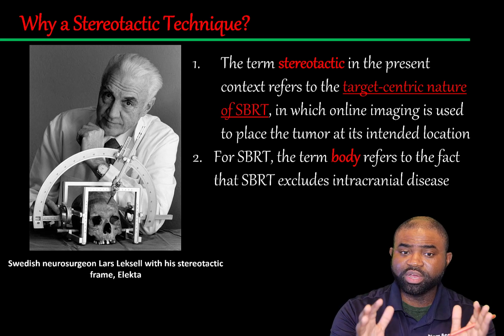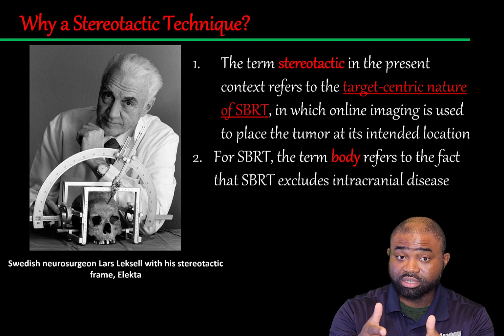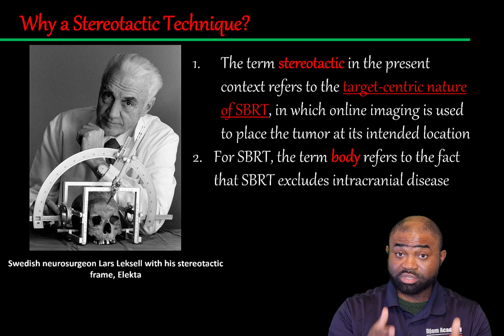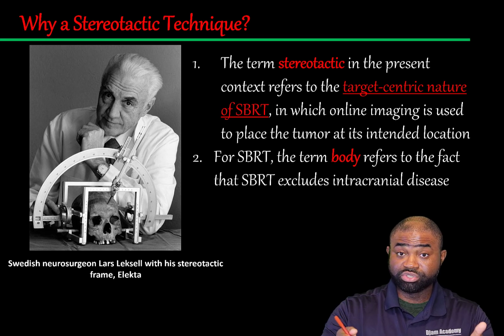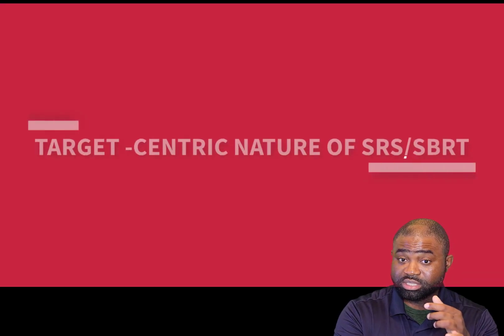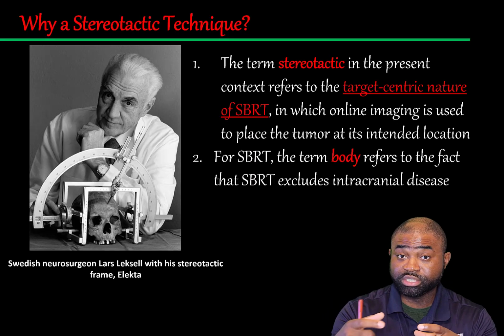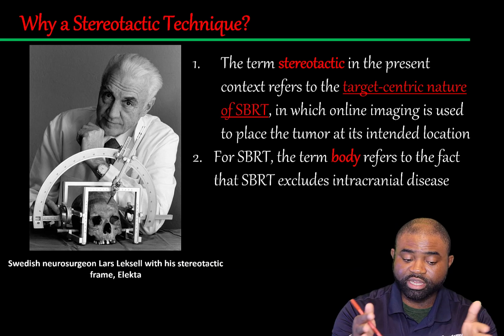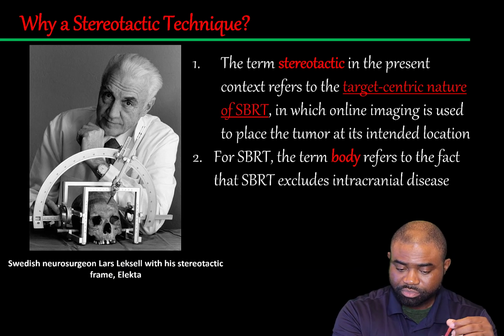To summarize, the term stereotactic in the present context of Linac-based radiosurgery refers to the target-centric nature of the process, which employs online images to help in target localization.